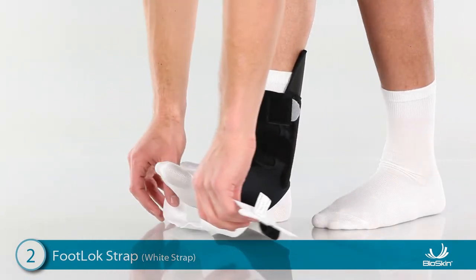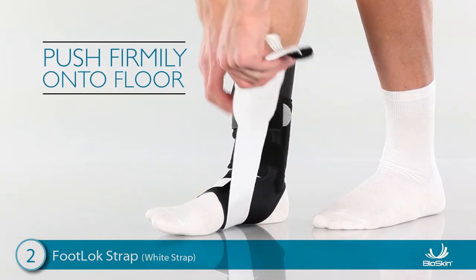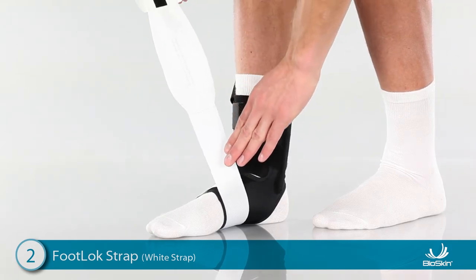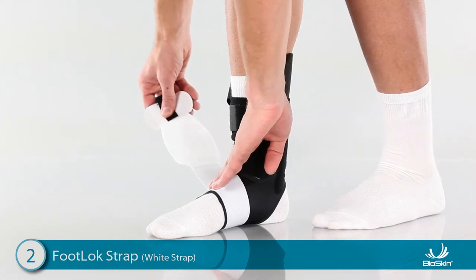Next, wrap the footlock strap underneath the foot and push the foot firmly onto the floor. This allows the foot to expand when body weight is applied. Continue wrapping around and press the strap onto the white side of the Velcro tab on the top of the foot.